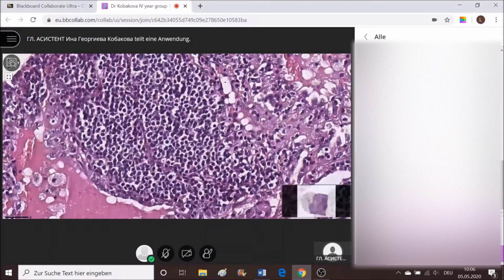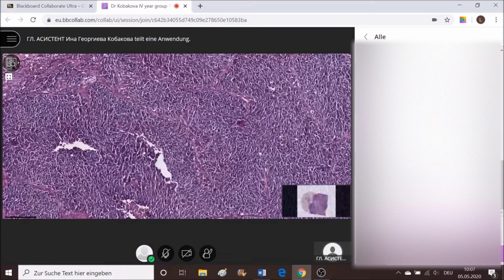Great. Yes, stromal reaction is majorly due to accumulation of inflammatory cells at the periphery of the tumor, which are trying to demarcate the tumor growth and the tumor process. So what we reach is a further region, which is made of cells which are completely identical to each other. They're looking like clusters of nuts and nests of cells which are not well demarcated by fibrous tissue strands. You see that the stromal reaction here is very sparse. It's not much in between the nests of cells.